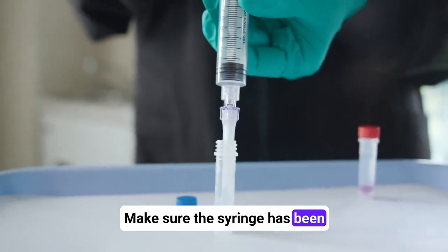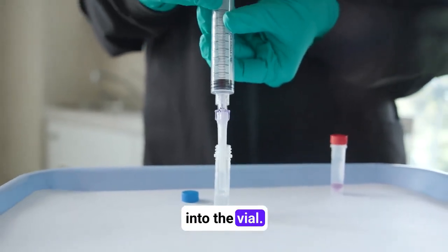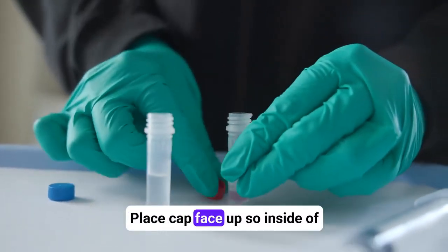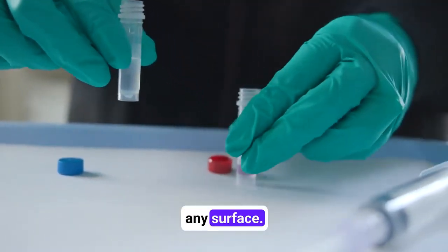Make sure the syringe has been completely emptied into the vial. Remove the cap of the test vial with the pink liquid. Place cap face up so inside of cap does not contact any surface.